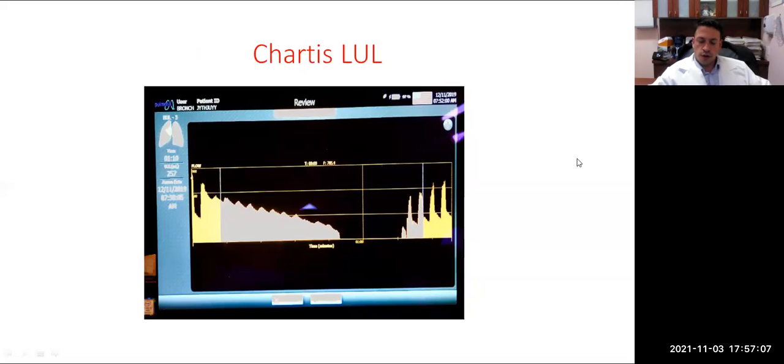Over the last 2 years, as we've gotten more comfortable with this entire program, I have noticed that you can correlate the amount of time it takes for that flow to go down to how complete the fissure is. If you have a perfect fissure, you will see what you have on the screen. But that is an exception.